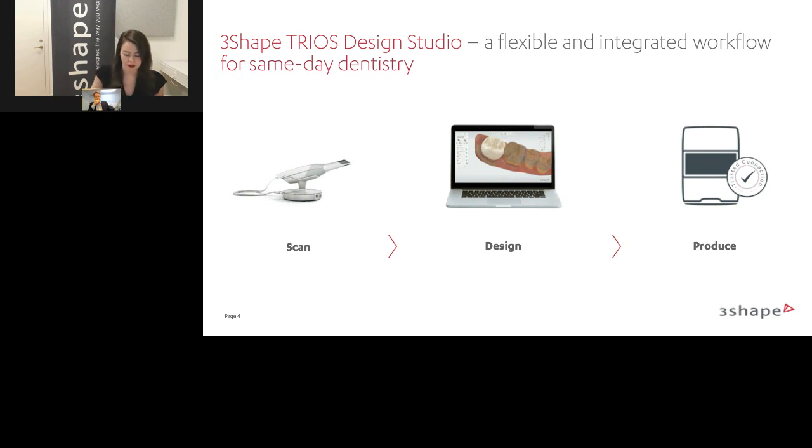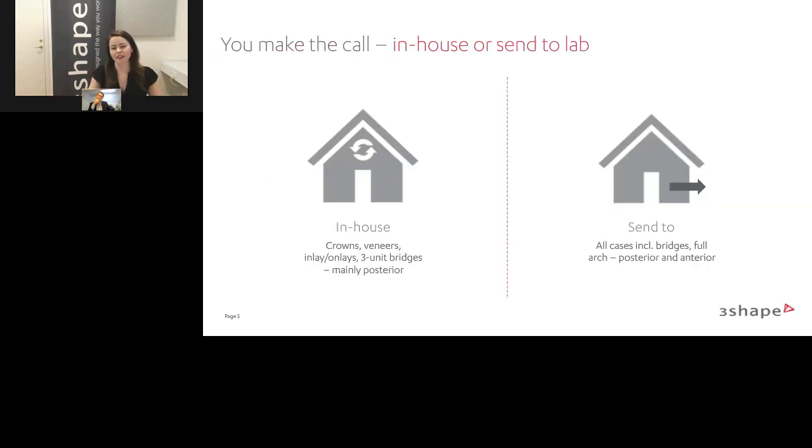Let's go on to the next slide. This is something that I believe Doug can say something to. We think it is important for everyone to work with the kind of restorations that they feel happy working with. So if it is just a molar crown or an inlay that you want to produce, and anything more complicated or more advanced than that, you might want to send out to a lab. Or what do you say, Doc? If you're very busy, will you sometimes send an indication to a lab and go about it that way?